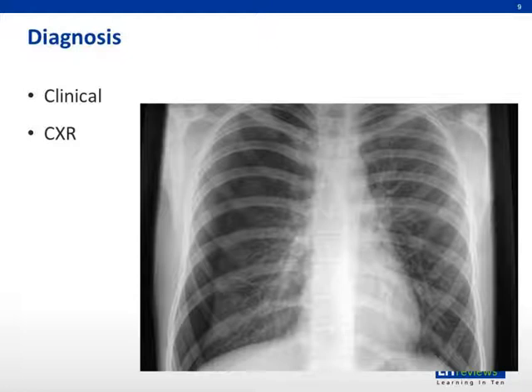The diagnosis of pneumothorax is made both clinically and with imaging. Patients who are hemodynamically unstable or critically ill require a prompt clinical diagnosis in order to enact appropriate treatment. This typically involves listening for breath sounds on the side of the suspected pneumothorax. Additionally, diagnosis can be made, and is more frequently made, with a basic chest X-ray. This can demonstrate air in the intrapleural space and adjacent collapse of the lung, as is seen here on this chest radiograph, demonstrating a right-sided pneumothorax.